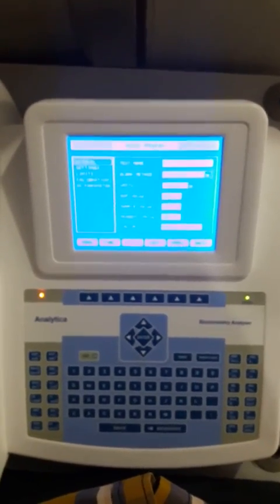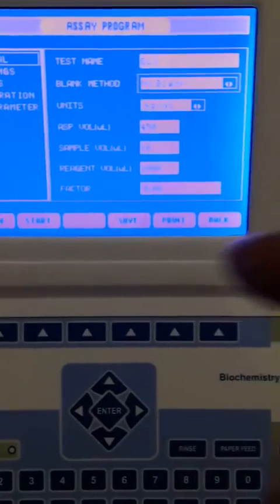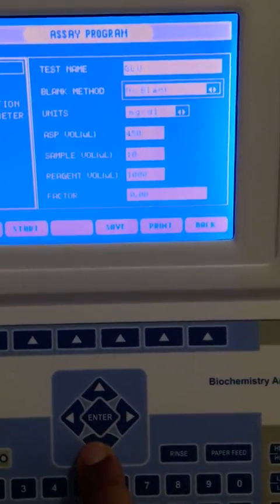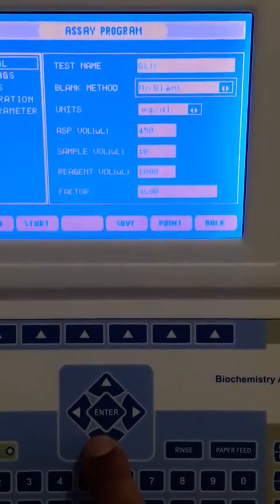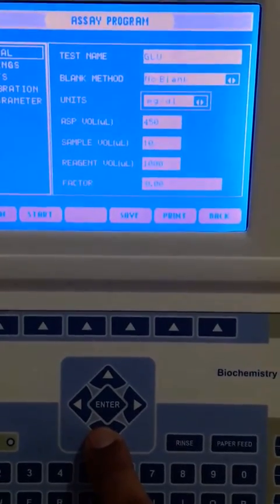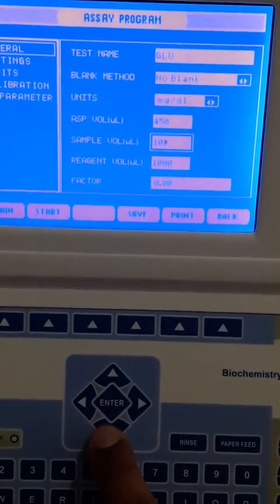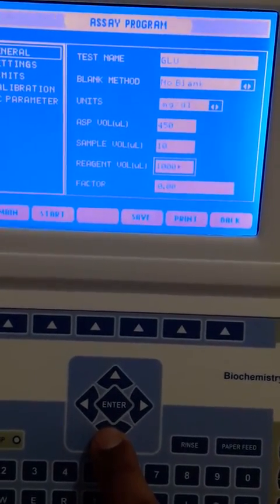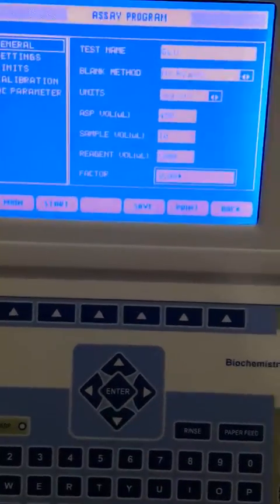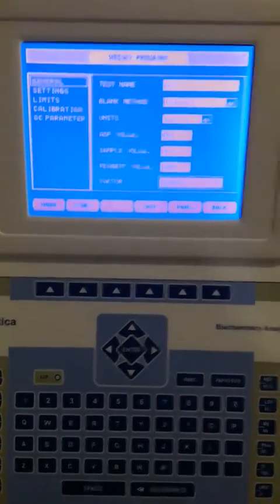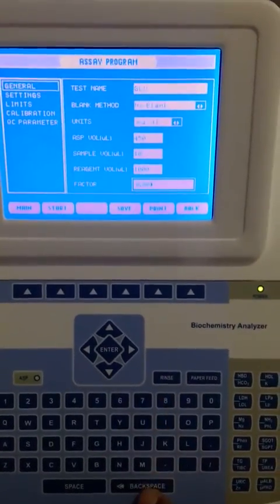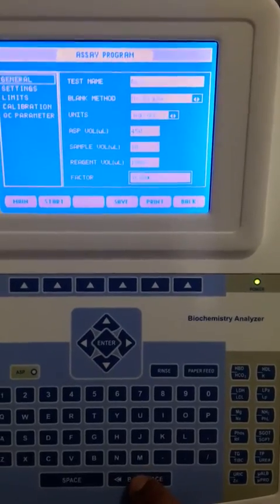I have now entered the parameters as per the literature. In General, I have entered: glucose method is No Blank, the unit is mg/dL, aspiration volume is 450, sample volume is 10, reagent volume is 1000. For the factor, we have to calculate it because this is an endpoint method.